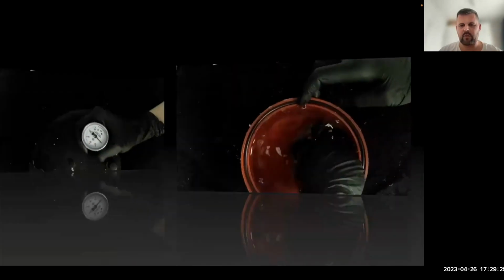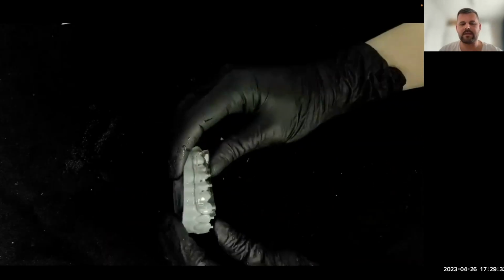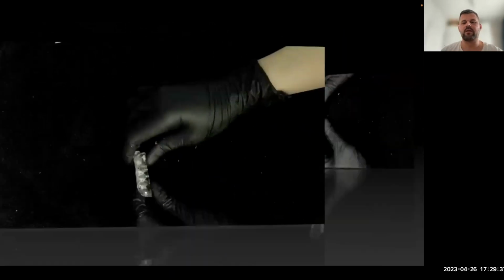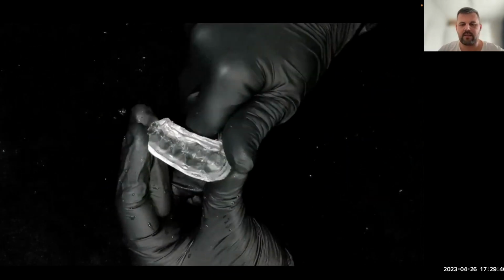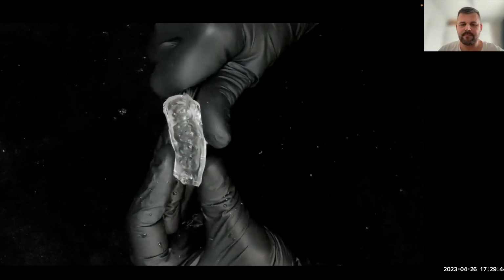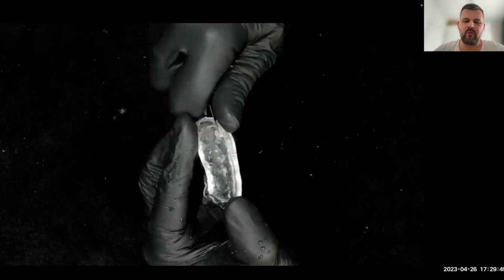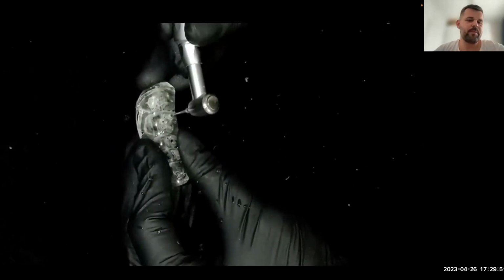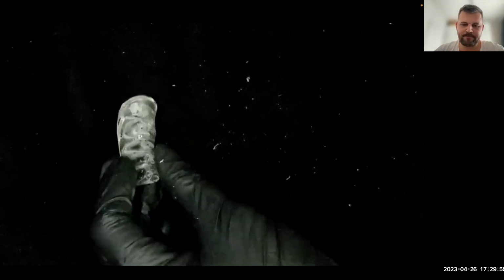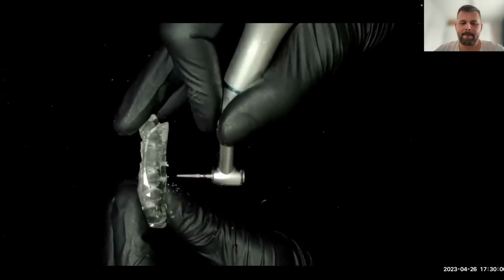But this time they will be connected together. There will be one silicone index which is stiff. Of course, you can remove the overflows and the excesses with a scalpel, and when you remove them, it will be easy to make the holes in the proper way, in the proper place. And of course, you have the burrs for this from my set.